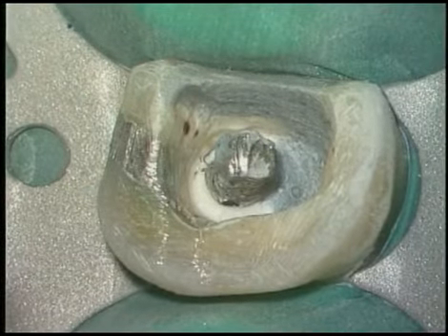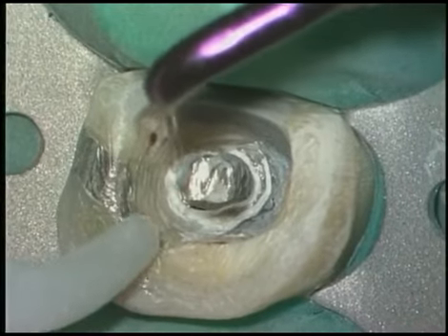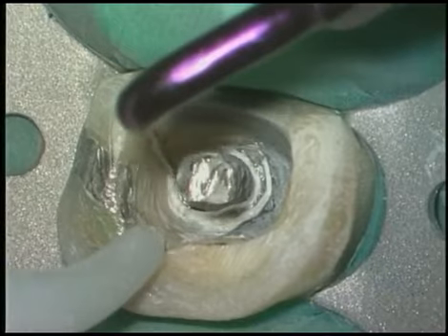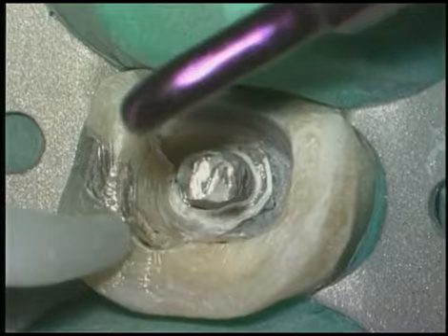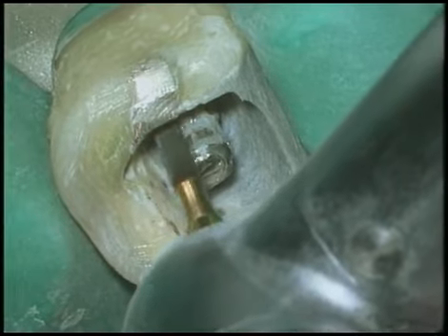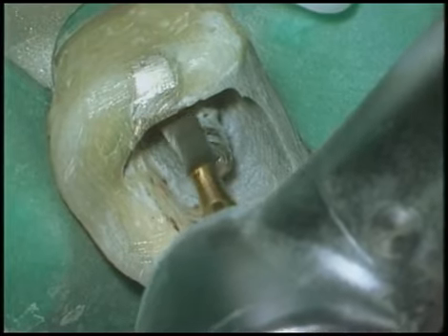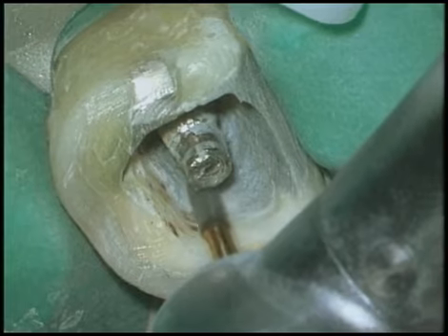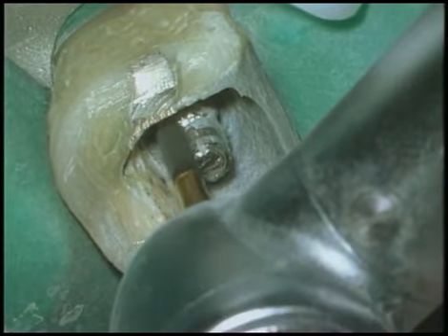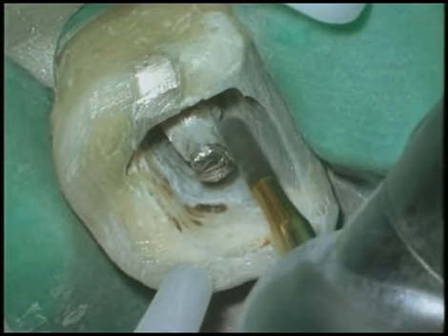Notice the cross-sectional diameter of this post. A Pro Ultra number 6 has a thin parallel wall profile and can fit nicely between the post and the axial wall and can be used to sculpt away restoratives. A transmetal burr is now selected to machine down the post. Some of these posts have such large cross-sectional diameters that it's wise to mill them down before commencing with using the post removal system.